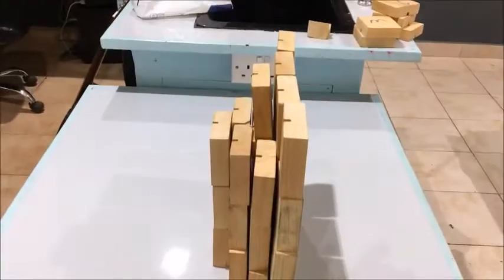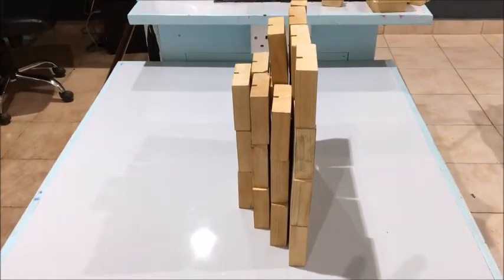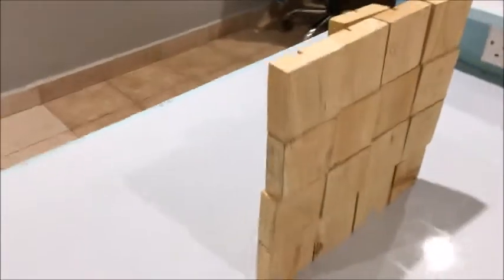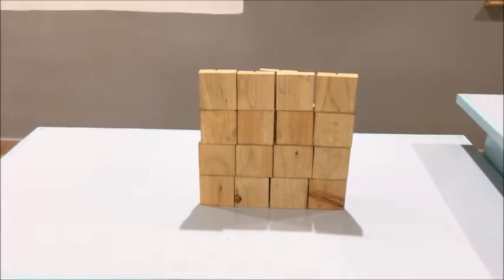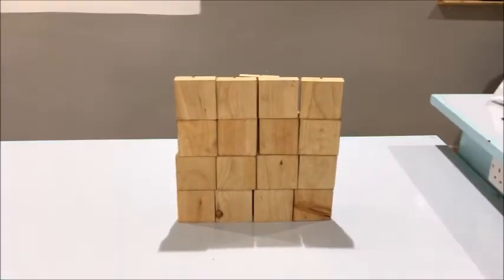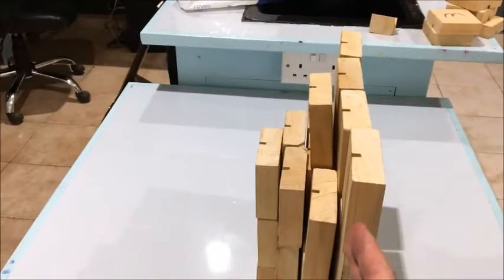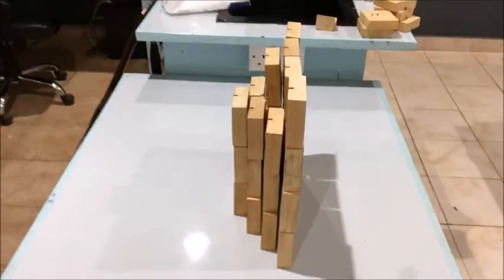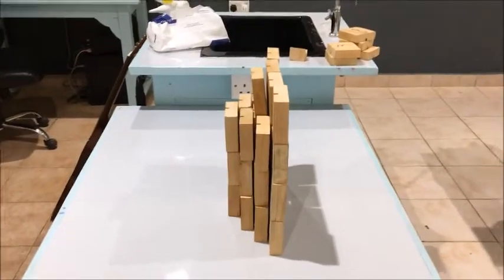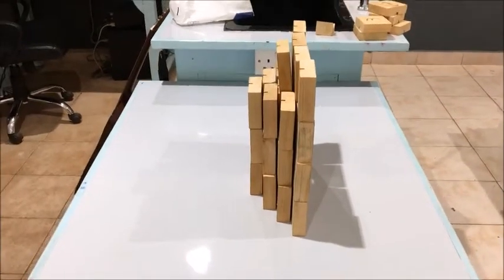So I'm going to explain how this works. If you can imagine, each of these is a slice. I've got 1, 2, 3, 4 slices of voxels there to make up my three-dimensional image. And instead of me x-raying from this direction, a CAT scan is actually more like an x-ray going through the other direction in very thin slices, which is like that. In other words, I x-ray this slice and this slice and this slice and this slice, and then the computer puts them all together to find out the full three-dimensional shape, and then it's created on the computer so that you can move around it and find out what it is exactly.